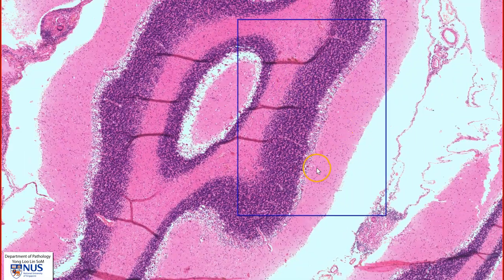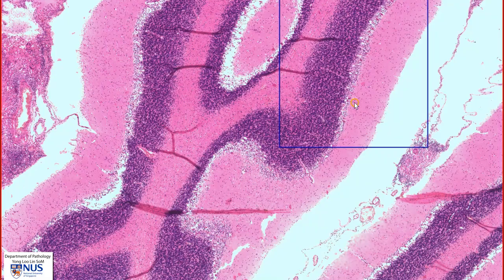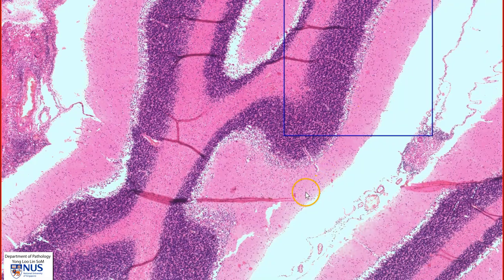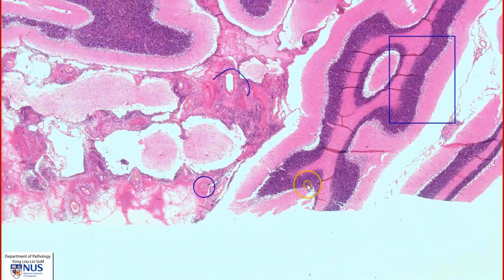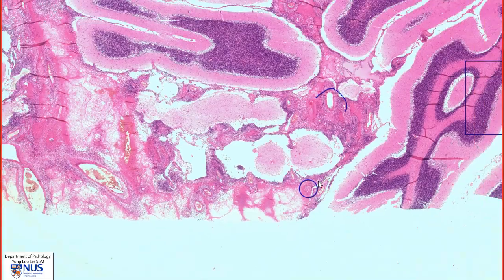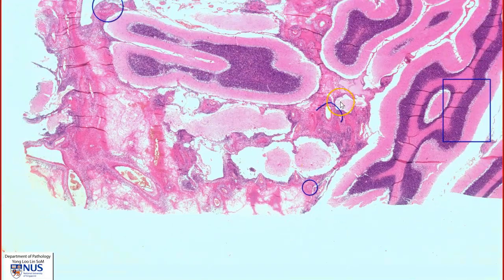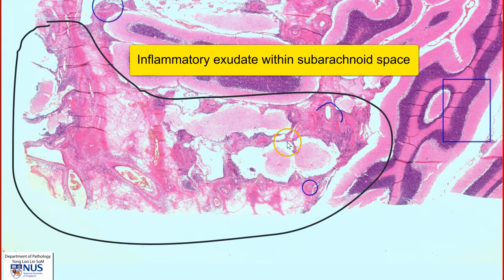This cerebellar parenchyma is unremarkable — it is viable, and there is no involvement by TB. Let's move on to the abnormal area, which is this entire area here.